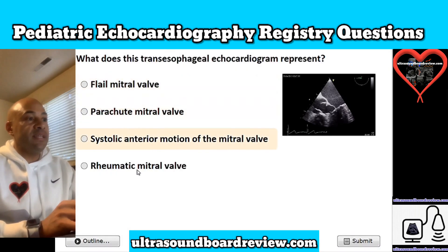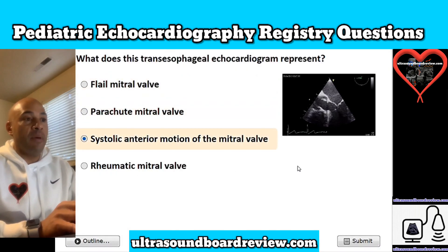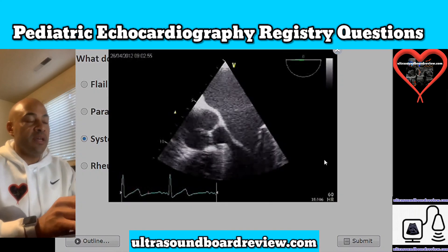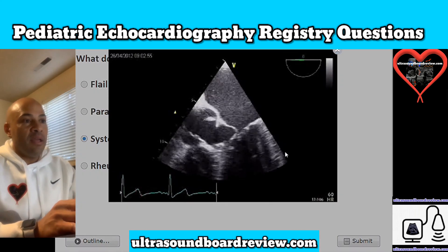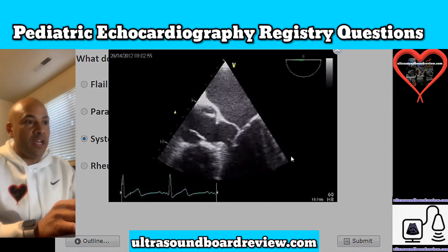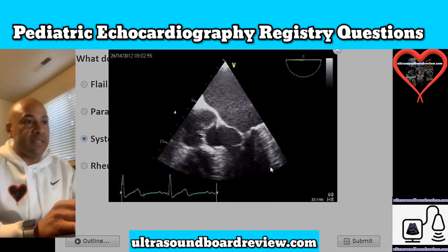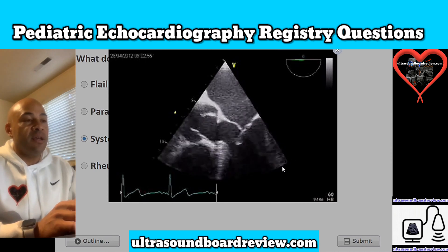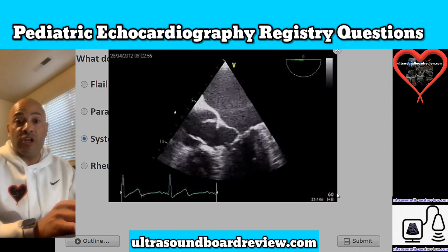The answer is C, systolic anterior motion of the mitral valve. You can see in this clip that in systole, the anterior mitral valve leaflet is being sucked into the LVOT tract causing an obstruction.